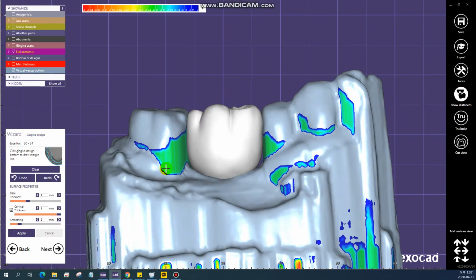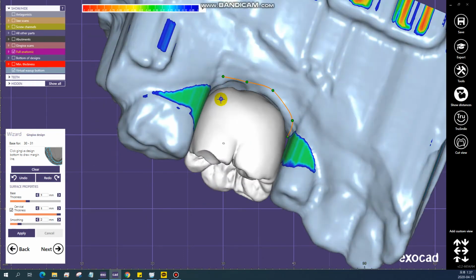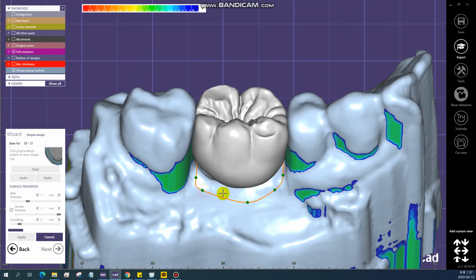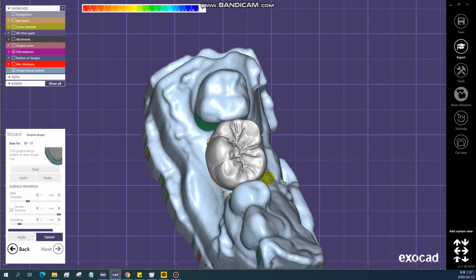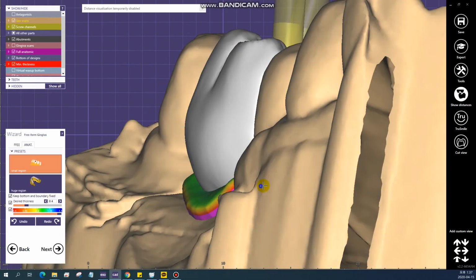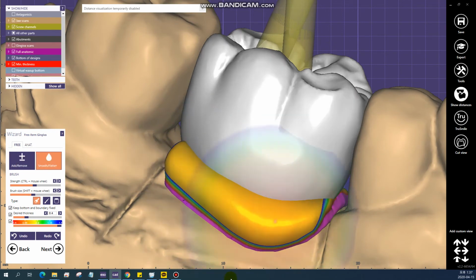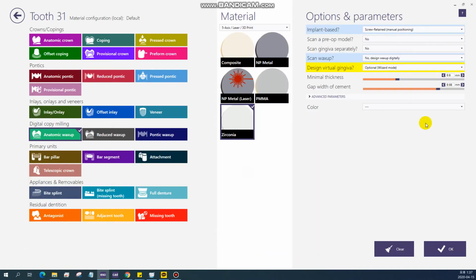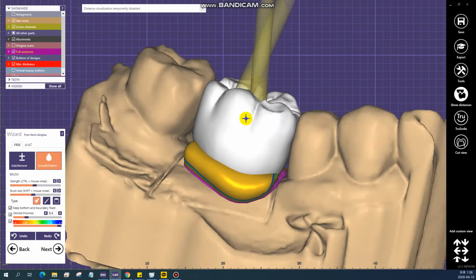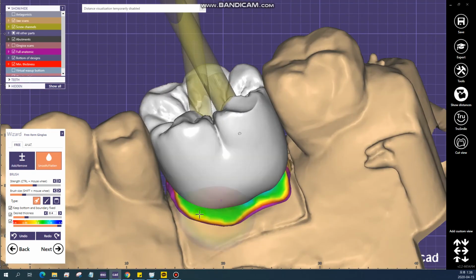Okay, now you can make it with the gingiva if you want or not. Whatever you want, you can add it. But sometimes the doctor wants it after the work is almost done, then I have to make it manually, so it's killing me sometimes. That is why I like to add it when I first make the job definition. I always put them in optional. Not always, but especially for implant cases, or big units, or full arch and something like that.